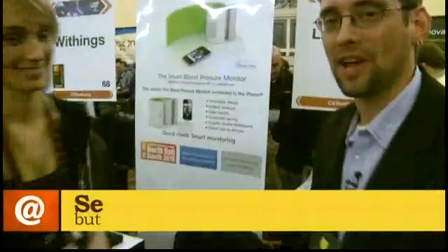I'm Chuck Rutherford from butterscotch.com here at CES 2011. We all know that wireless gadgets can sometimes help raise your blood pressure, but how about wireless stuff that will actually help you monitor your blood pressure?